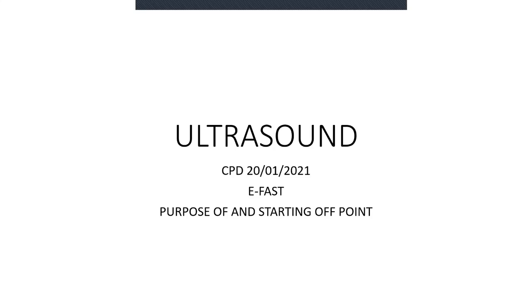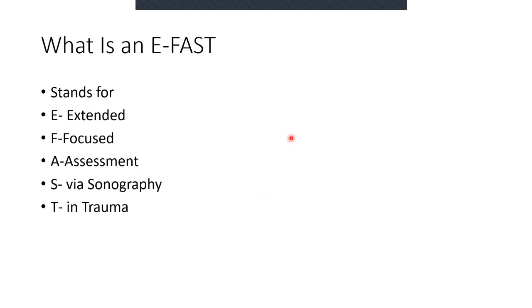So let's go. Today we're going to start talking about ultrasound in the emergency and outpatients department, which is where most of us are working. So what does EFAST stand for? It doesn't stand for a fast ultrasound that's done electronically, like an EFT or something like that. It stands for extended focused assessment via sonography in trauma.